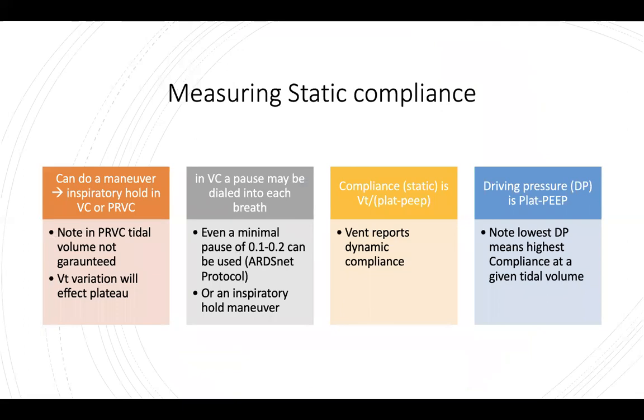So again, in order to measure the plateau in PRVC, since there is no end inspiratory pause dialed in, you can hold that maneuver button and inspiratory hold, and you'll get a plateau. But since the tidal volume is not guaranteed, there may be variation in tidal volume from breath to breath. There may not be, especially if the patient is adequately sedate, but that change in tidal volume will affect the consequent plateau. In volume control, again, you can set an inspiratory pause at the end of each breath, and it can be as short as 0.1 to 0.2 seconds.